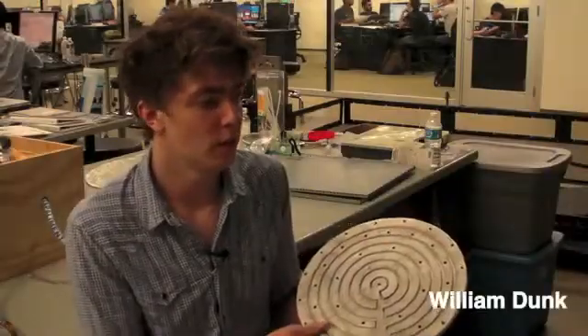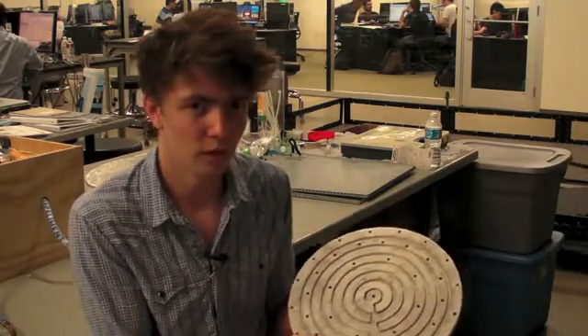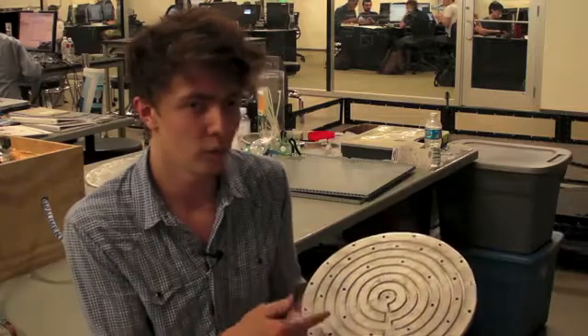The idea behind the hot plate was to make the design easy to use, because everyone's familiar with the traditional hot plate — that's what they use. They're just powered by propane stoves. Here, we've gone for a renewable design.